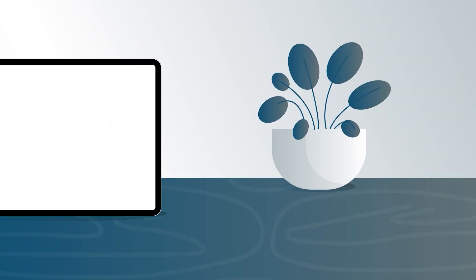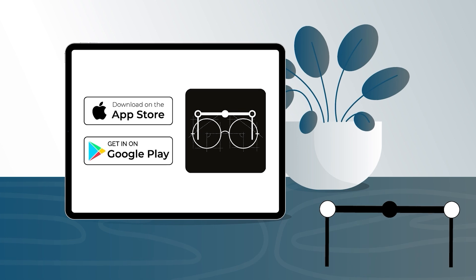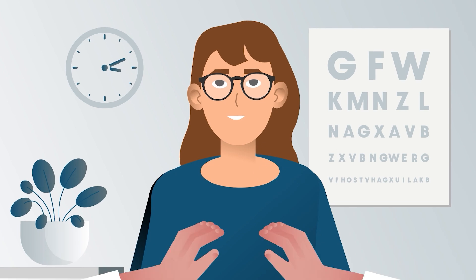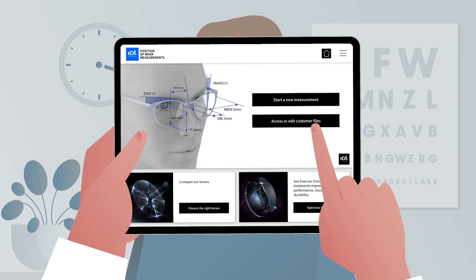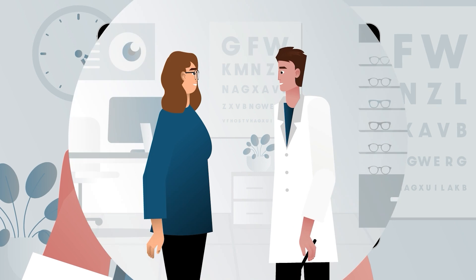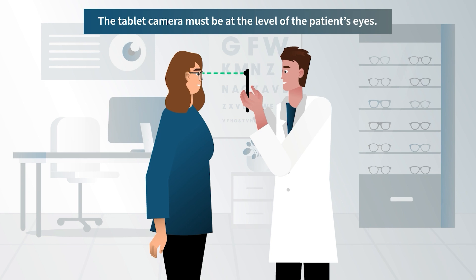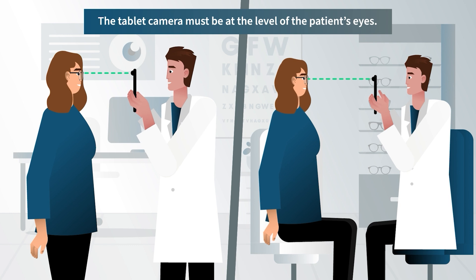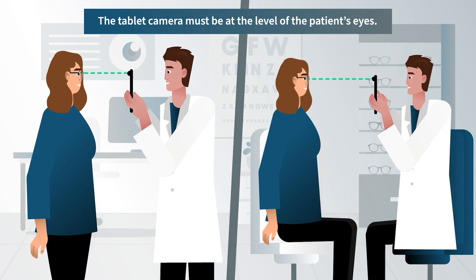Let's get started. You just need a tablet to install the IoT POW application and the reference frame you received with your user license. First, take a photo from the front. The tablet camera must be at the level of the patient's eyes. The patient and optician can be standing up if they are the same height, or seated if there is a difference in height. Ask the patient to look at the camera lens on the back of the tablet.